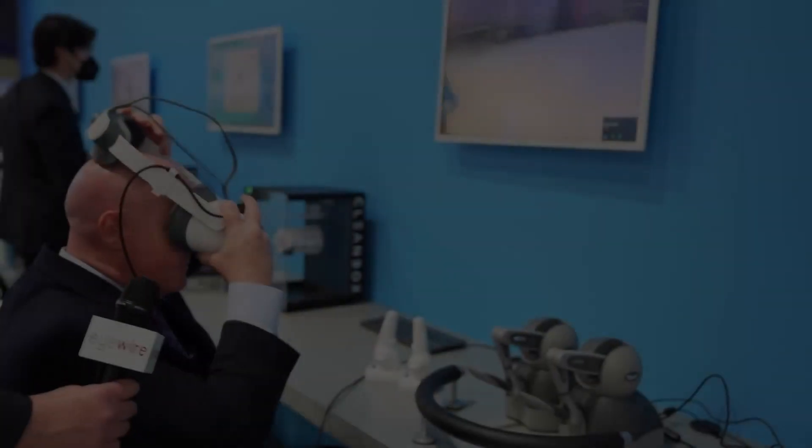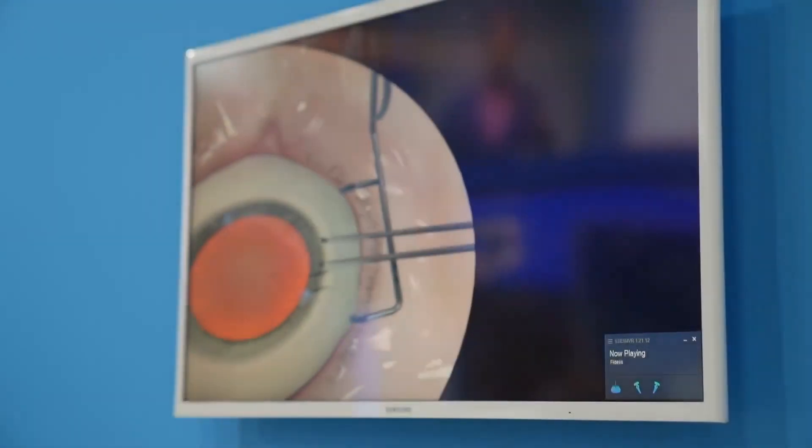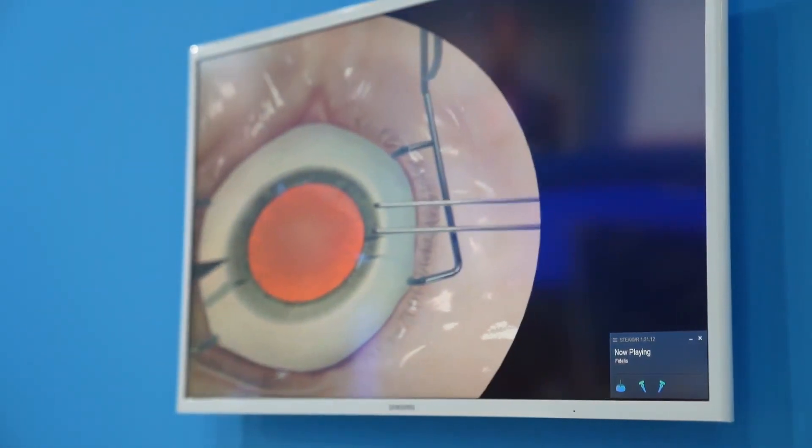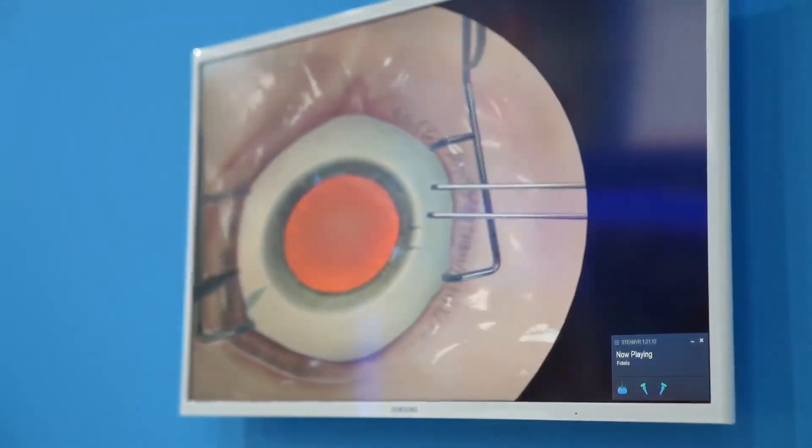When you enter the surgical simulator, you'll initially be in a virtual OR. Within Fidelis, we've broken it up into 11 basic steps. The first step being creating the paracentesis or side port incision.